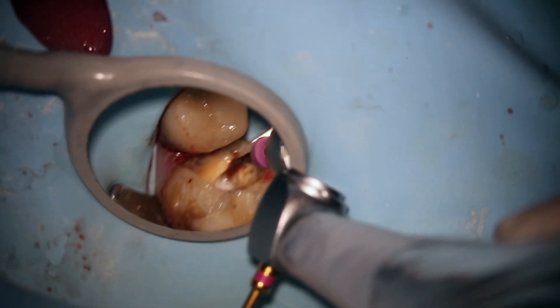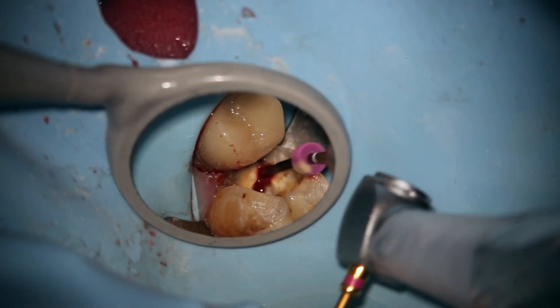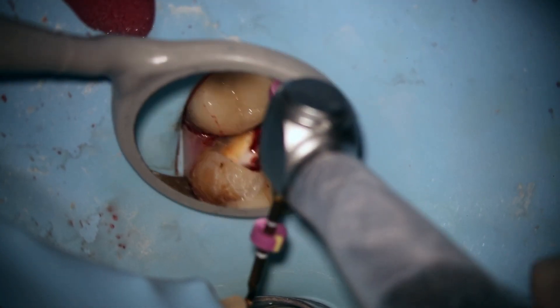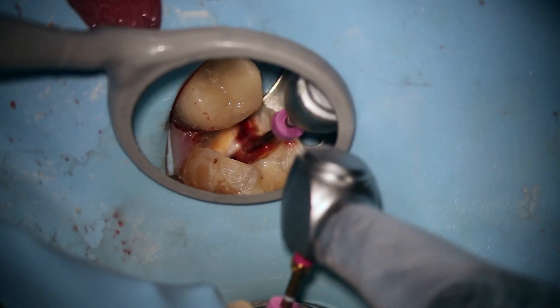I have my estimated working lengths: palatal is 26 millimeters, MB1 and DB are 22 — those are from the CBCT. MB2 gets an optional middle flare. I already did a coronal flare; now I'm using a ProTaper Gold Shaper 1 at 300 RPMs, 5.2 newton-centimeters torque. I like high torque because I'm being very gentle, just going down and opening up the middle part of the tooth. This is a hybrid technique — a little trick that makes you really efficient. Shaper 1 is brilliant.